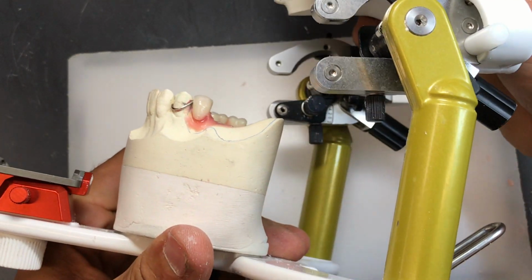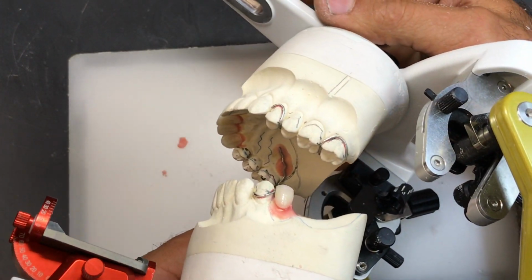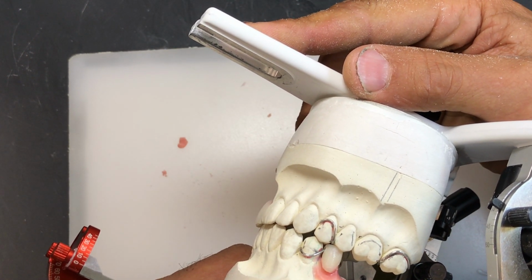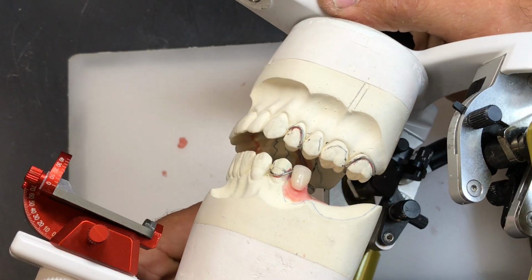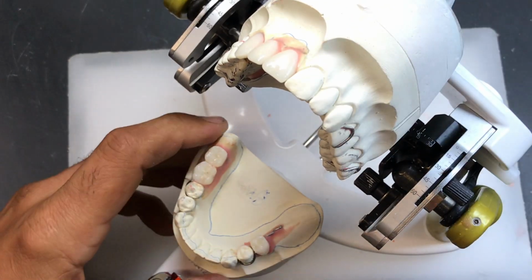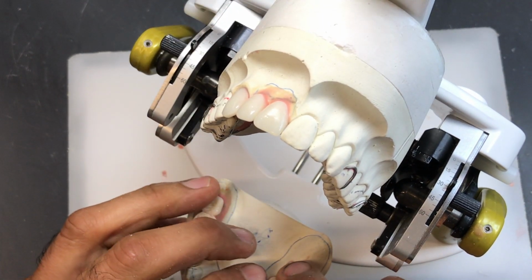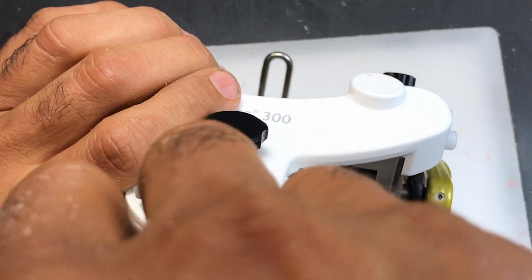Somewhat okay. Let's see how this relates to the opposing as I'm closing the articulator. Looks okay. Looks like I'm intercuspating fairly nicely. I've got a bit of an opening with my bite. I'm going to move the tooth into a little more of a lingual position. Place my pin back on here now.